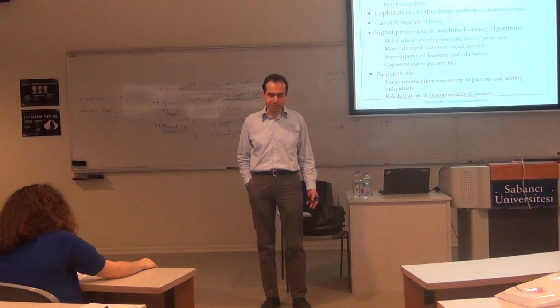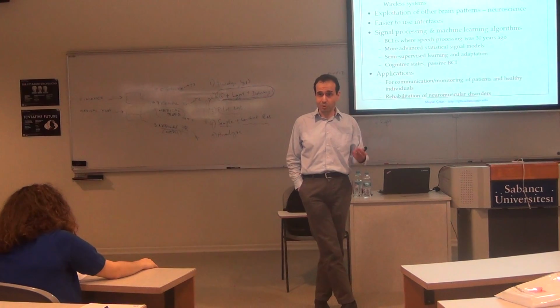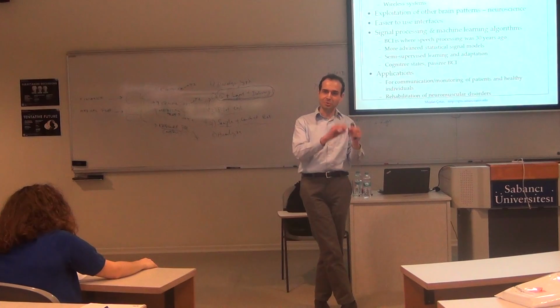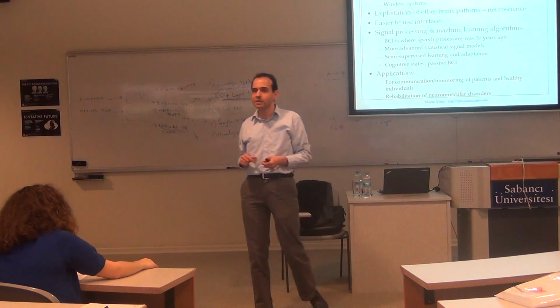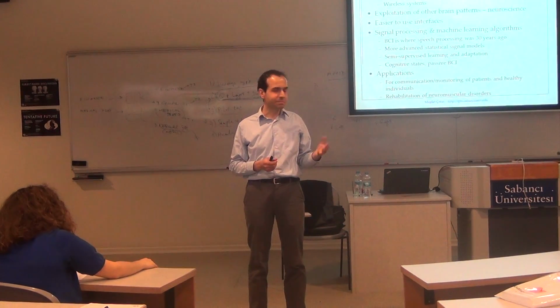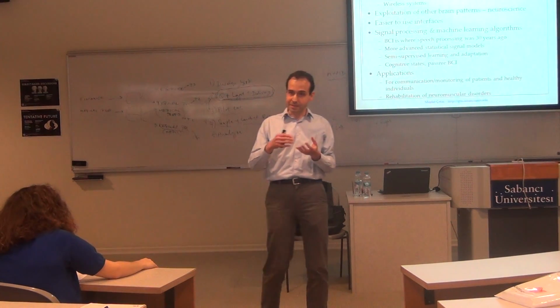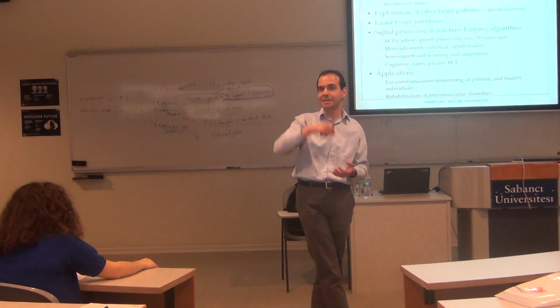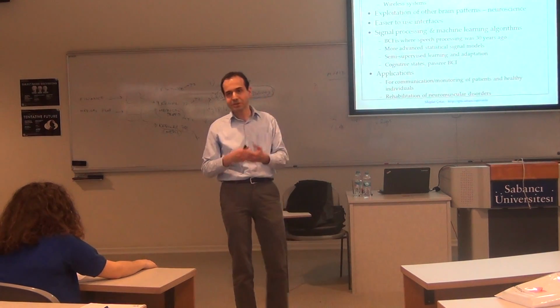In experiments in which we do motor imagery, we pretty much know that the strongest signals are from the motor cortex, which is the two electrodes here called C3 and C4. And you should collect those and maybe things around them. Whereas in other applications, in Ozan's work, we are interested in collecting data from something like 64 channels. In a spelling experiment, maybe we collect data from 10 to 12 channels. When we collect data, basically we have a long vector of features. We concatenate them together. And then we learn in this high-dimensional space after feature extraction. So that's how.